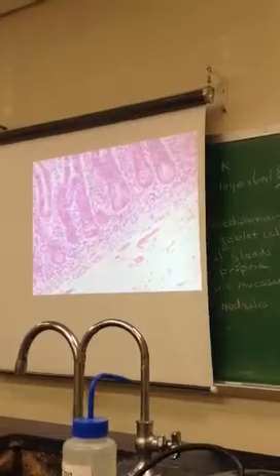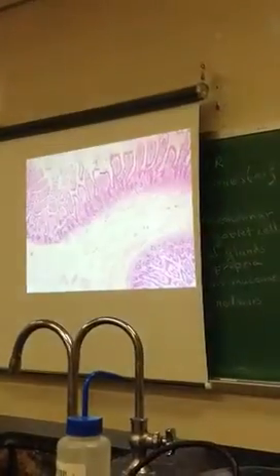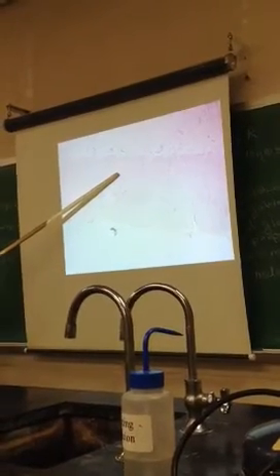All right, so outside the submucosa is the muscularis externa layer. And so we'll come down here. So there's our muscularis externa layer, and you should be able to see both layers. So tell me when the layer starts to change. Oh, good job. All right. So we see this kind of line here. So above that would be what layer? Circular of the muscularis externa, and down here would be the longitudinal.